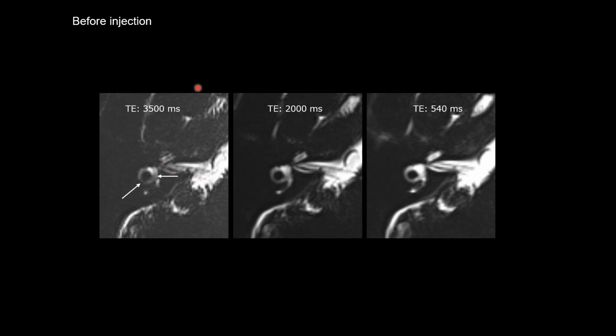But with this very long echo time, this is before injection, lateral semicircular canal is not continuous. There's some signal drop. So we have to shorten the echo time.